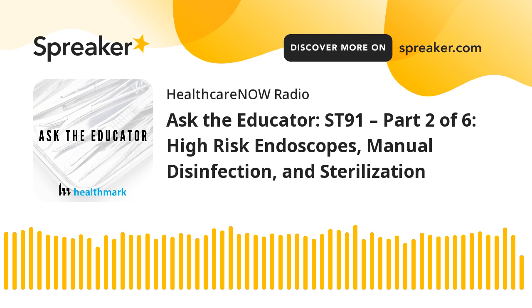Now, within ST91, we do tell you what are always considered to be high-risk scopes. And then we also say, and any that your facility thinks should be high risk. So let's start with those that are always high risk. You have your duodenoscopes, depending on how you like to say it. I'm in the camp of duodenoscope because that's what I like to say. Those are your ERCP scopes. And then you have the linear ultrasound scopes, also known as EUS scopes. They have that ultrasound transducer at the distal tip.